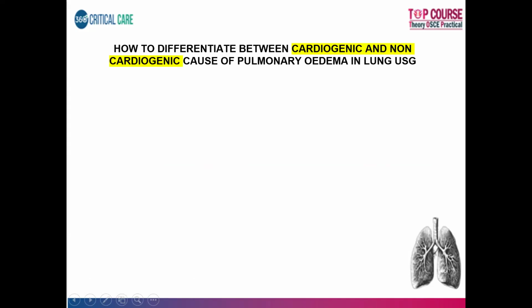Okay. So the next question would arise. We have been talking about B lines. We have been talking about pulmonary edema, and one of you, when we started, the first thing you asked was, "What is the use of ultrasound in pulmonary edema?" So when you're talking about pulmonary edema, can we differentiate between cardiogenic pulmonary edema and non-cardiogenic pulmonary edema using lung ultrasound?